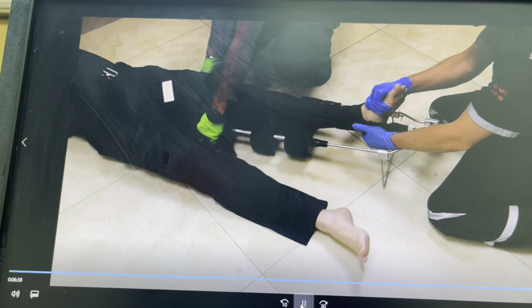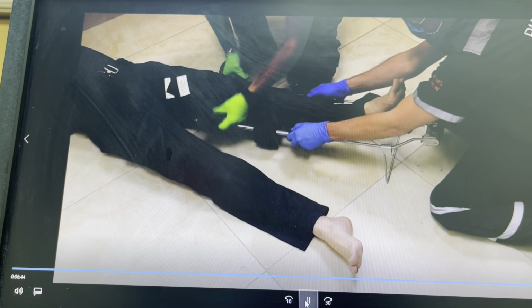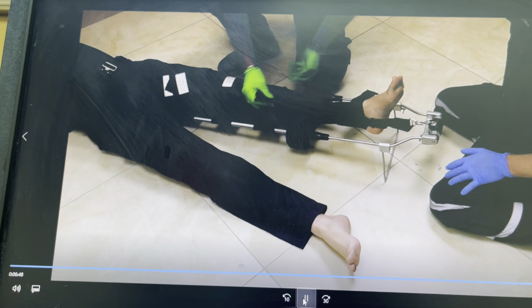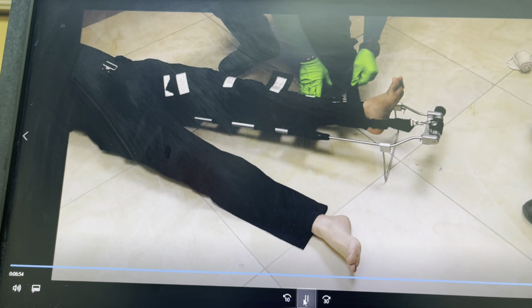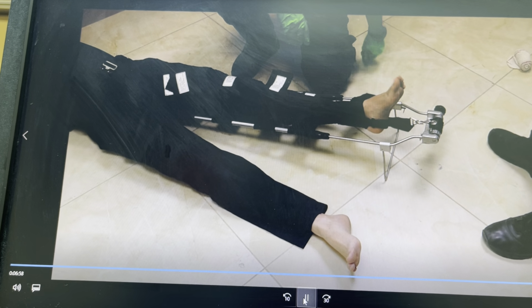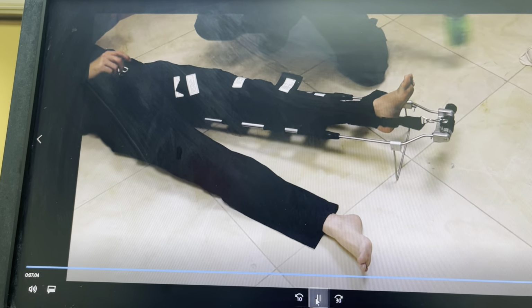Ask Practitioner 2 to release the ankle, allowing it to rest on the leg strap. Step 5. If the heel stand has not yet been lowered, lower the heel stand to assist in elevating the limb. Step 6. Adjust traction as required by unlocking and turning the ratchet system. Remember to reassess the perfusion, motor and sensory function.